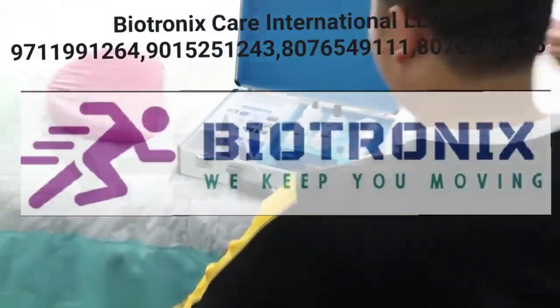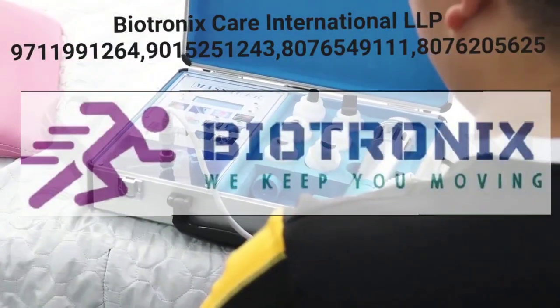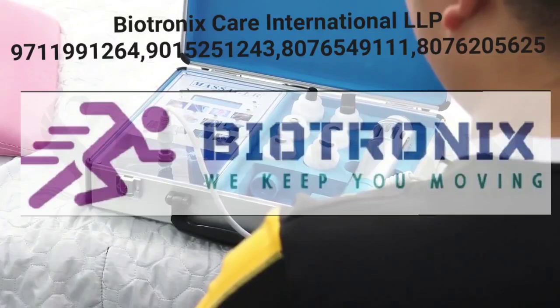And so this is another model. It's a very popular one. Of course, it's very flexible and it's a great try for guys to understand this one.